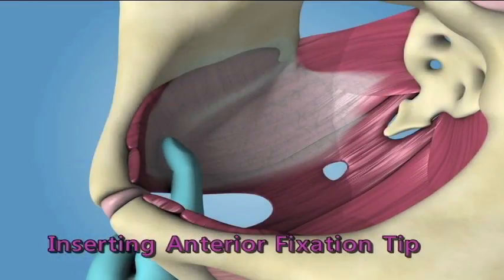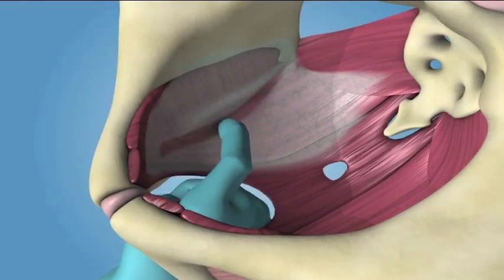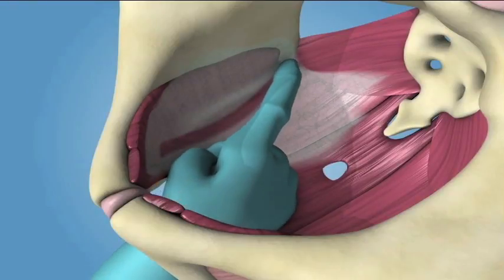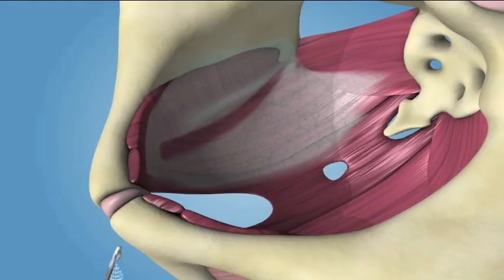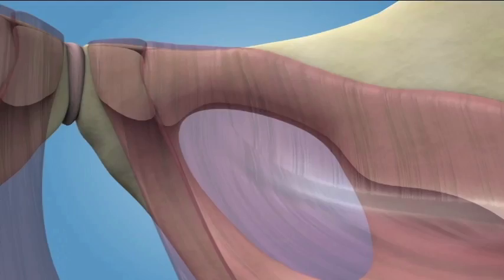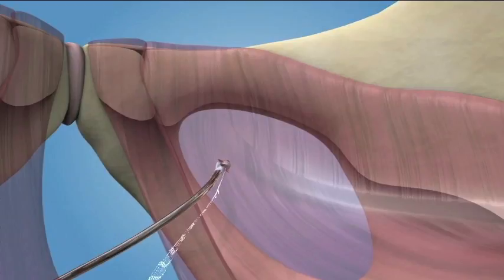Inserting the Anterior Fixation Tips. Aim the anterior needle tip towards the obturator foramen approximately 1 cm medial to the ischiopubic ramus while holding the needle curve against the index finger. The needle trajectory should be horizontal to the bladder neck. Using a lateral arcing motion, guide the needle around the backside of the ischiopubic ramus.